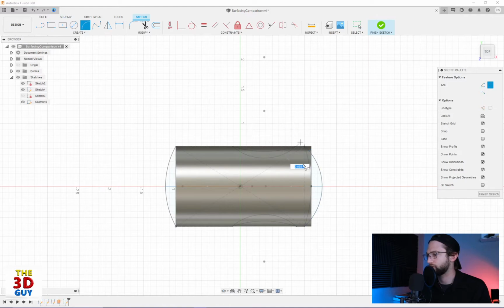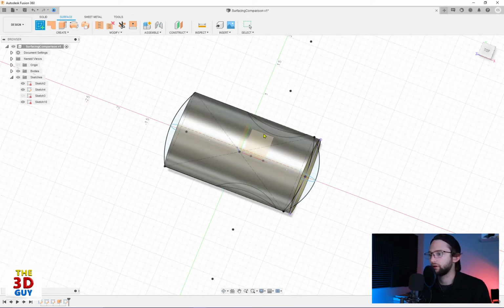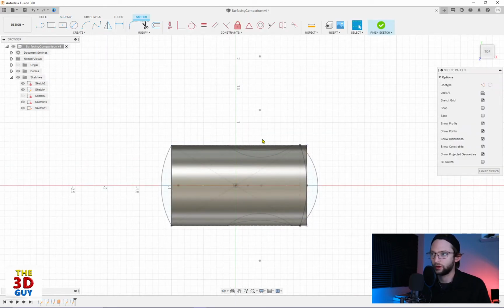And so great thing about having the original sketches already there. And while we're at it, we might as well create all these other... didn't want to do that. Don't want to be in that sketch.